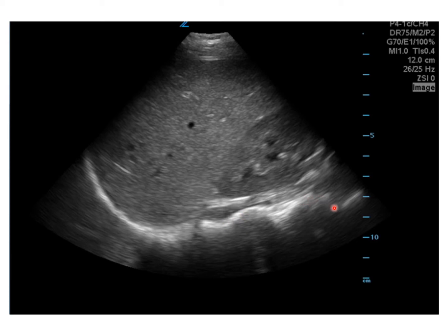From your physics lecture earlier, you learned that they are bright white. You can't see anything behind them. That suggests that they are something very hard and highly reflective, like bone. And you can see that there's a sort of repeating pattern of them. And we know that the probe, the head is up here, feet are down here. So if you haven't already said vertebrae repeatedly into your screen, these are vertebrae. Now what's interesting is you follow the vertebrae up, and I don't see any up here. Now you know that the vertebrae extend above the diaphragm, so why can't we see any more above the diaphragm?